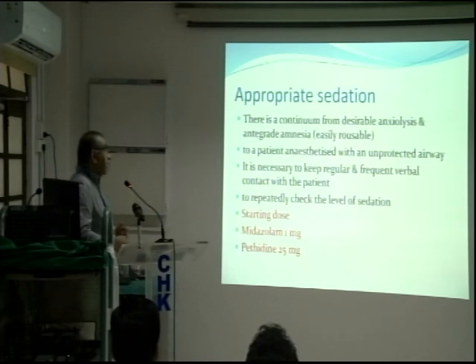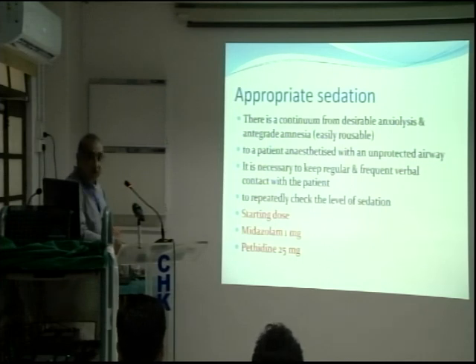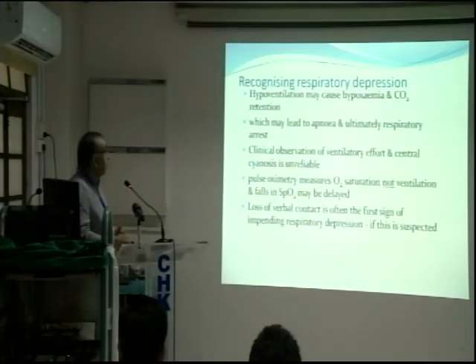And it's a very fine line between the appropriate level of sedation, under sedation, and over sedation. So you have to dose carefully. Normally, we start off with a low dose of midazolam, a low dose of fentanyl or pethidine, and then you just build up.